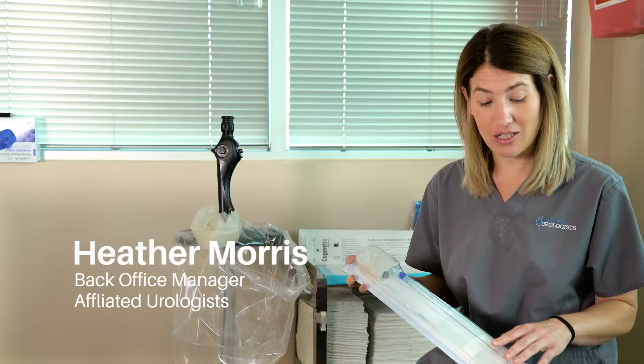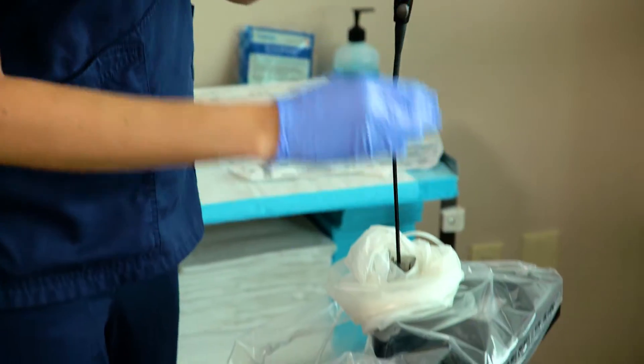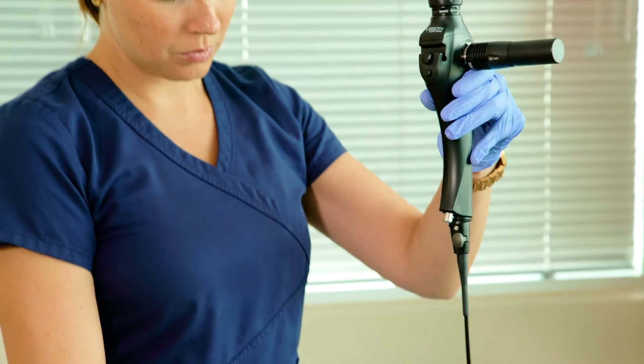This is the sterile sheath that it comes with. Every time you have a new patient, you just open it up, load it onto the scope and it's ready to go. Once you're done with the patient, you just unload it by removing it from the scope.